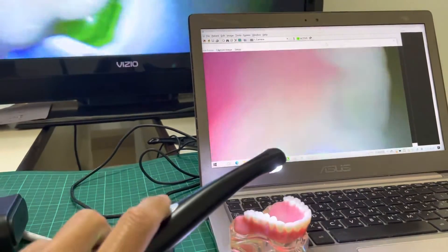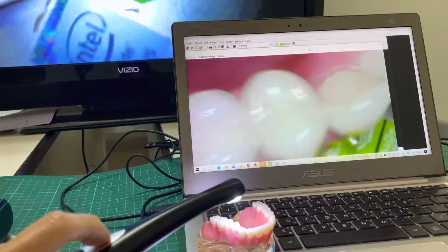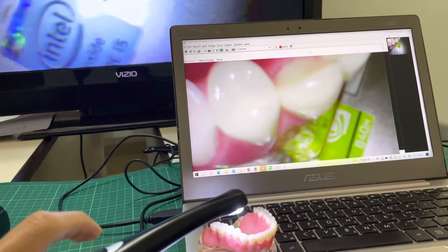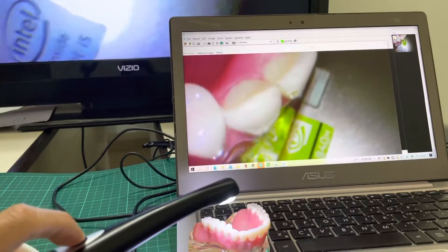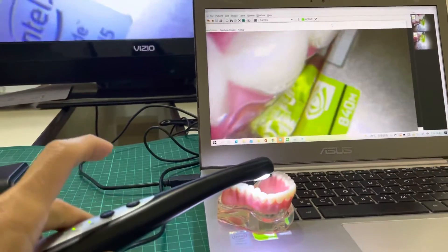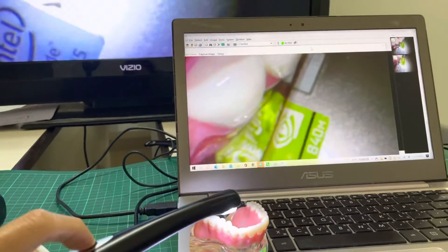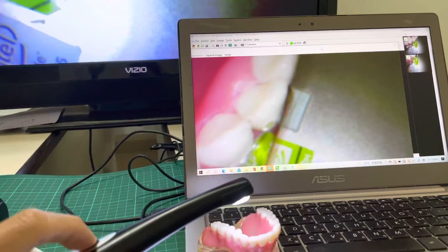So right now we are showing you how to capture with the capture button here. Push it — okay, you can get a photo from the intraoral wireless camera. So this is the button. The PC runs the image software, Dental Eye.